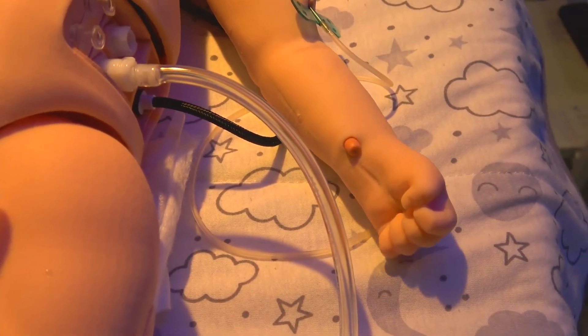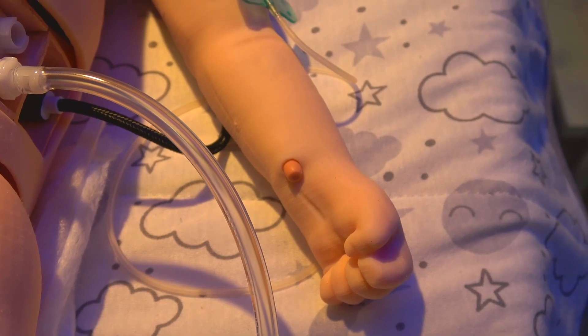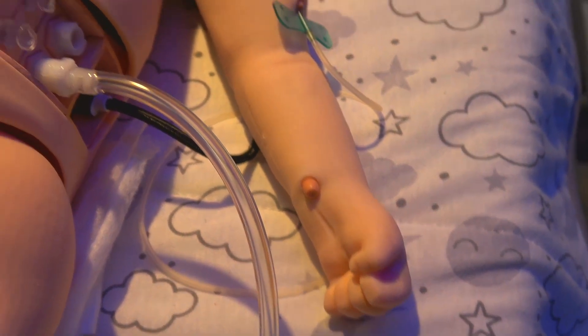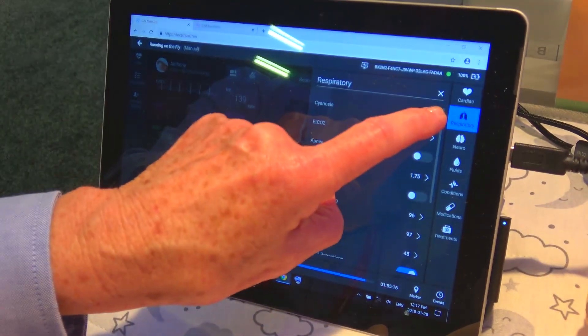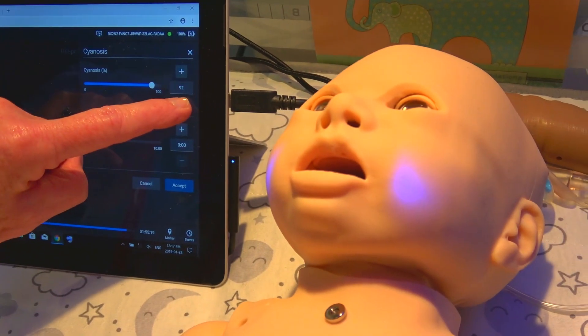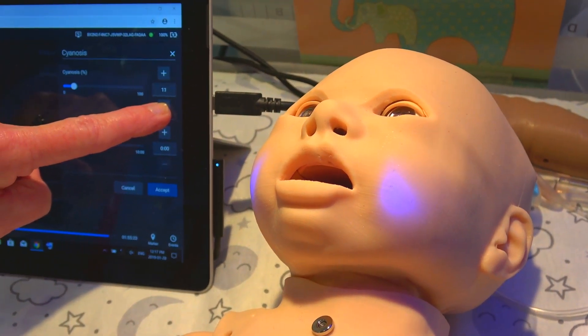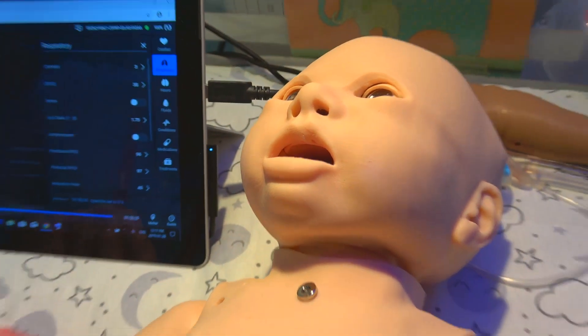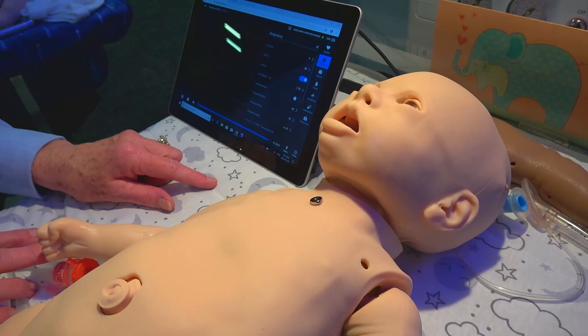It's also very easy to change vitals on the fly if you want to change your heart rate, blood pressure, or pulse rates, and to turn your cyanosis on and off. Making the patient apneic is all at the touch of a button.